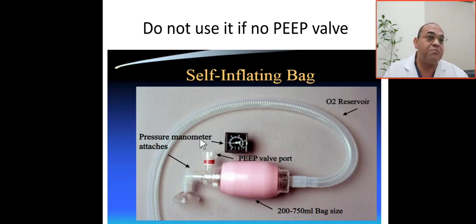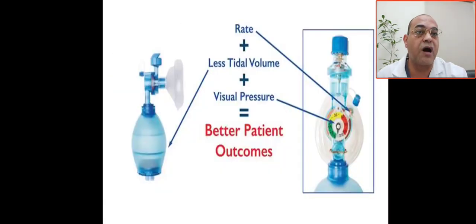It will give you benefit, but maybe you will harm the patient and will affect your outcome. After that, it will affect your quality indicators or key performance indicators in your unit. So use a pressure manometer to monitor the pressure you are giving, to prevent harm to the baby.